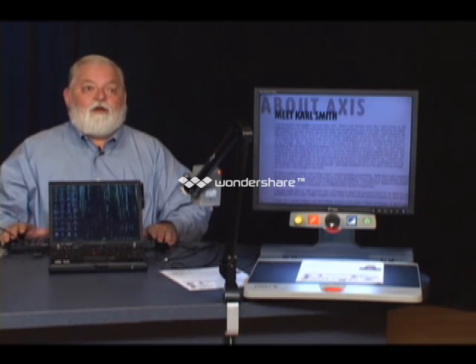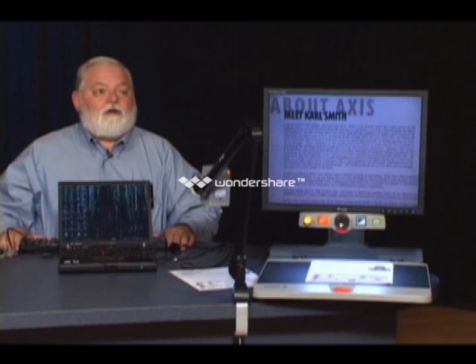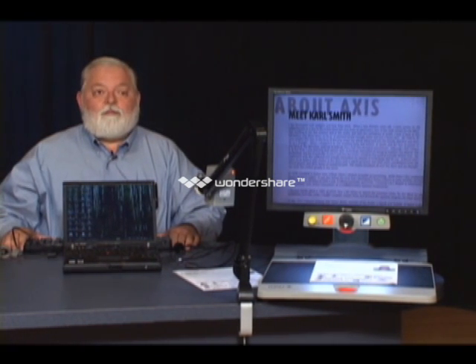This unit, and this is another interesting thing about low vision, which you may not have thought about. We talked about brightness and contrast and stuff earlier. Most people, when you say video magnifier, you think, well, the most important thing it can do is magnify, make things larger.